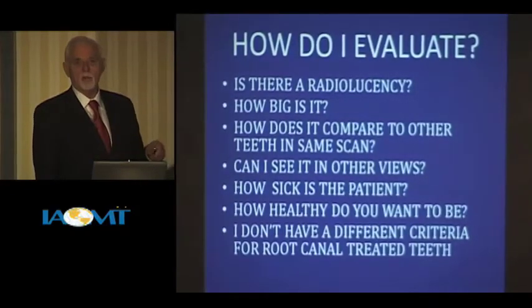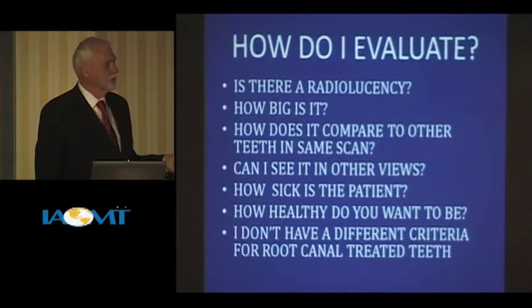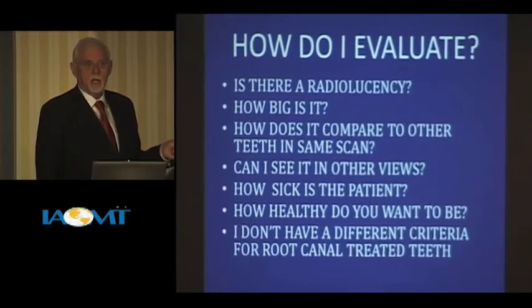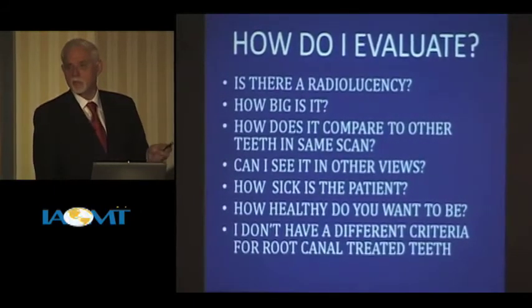Okay, how do I evaluate the CAT scan? Is there radiolucency? How big is it? How does it compare to other teeth in the same scan? Can I see it in other views? Same old. I like more than one source, but sometimes you get one view that's so dramatic you think, this is it, this nailed it.